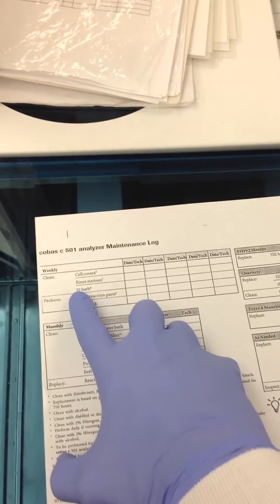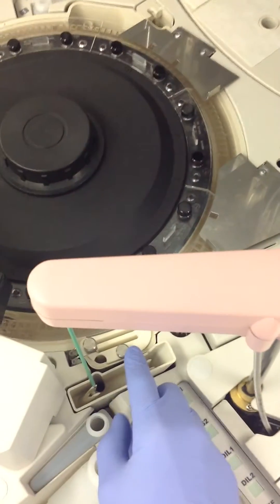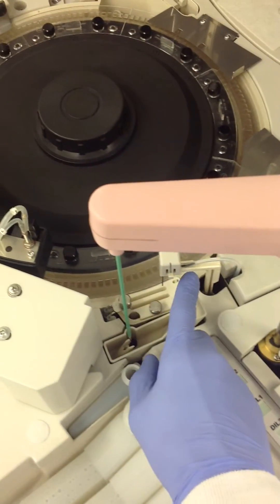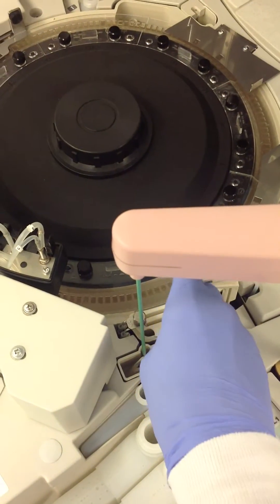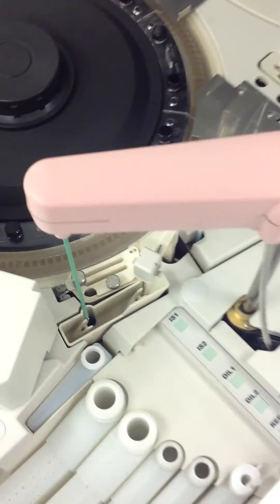Lastly on the 501 side, you're going to clean the ISE bath. This is the ISE bath here. Typically you're going to move the ISE sipper probe out of the way, and you're going to unscrew these, and then the bath itself comes out.